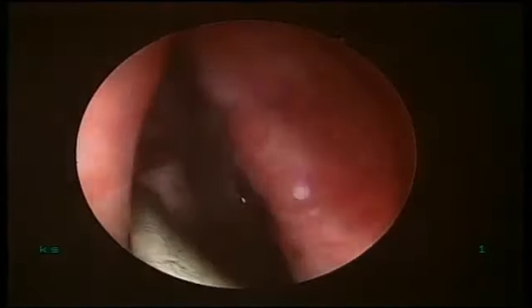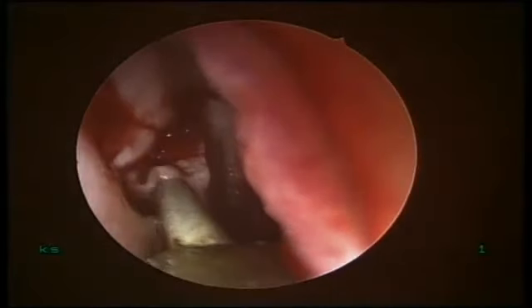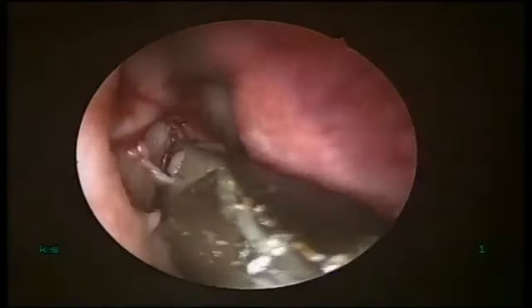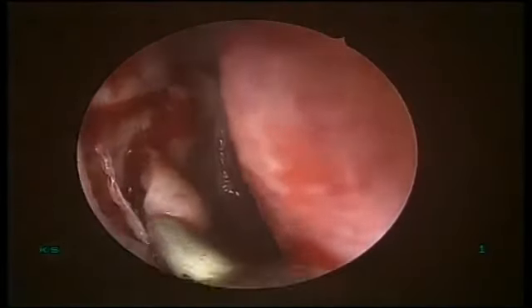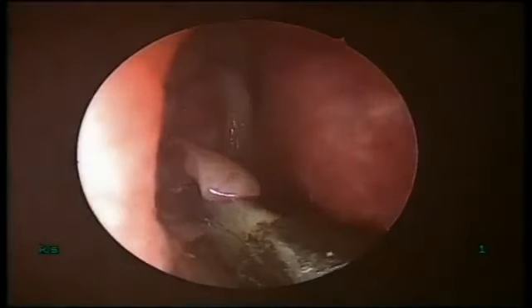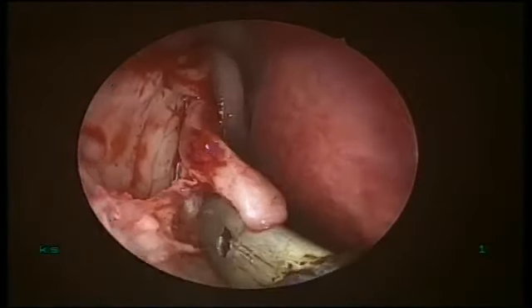See, you can easily elevate this flap. Yeah, this is a suction elevator. You can simply elevate this flap and push it posteriorly.